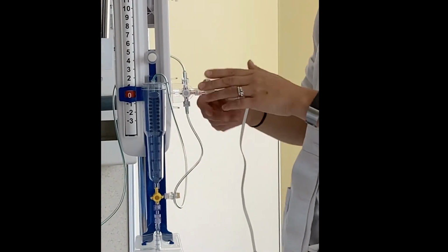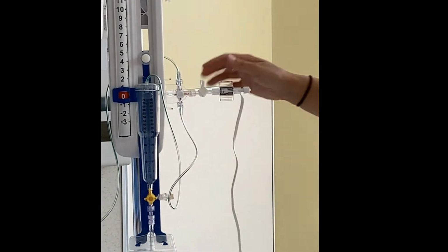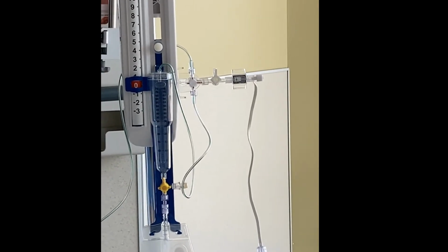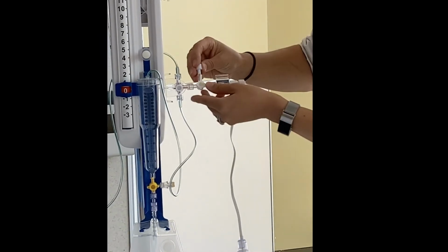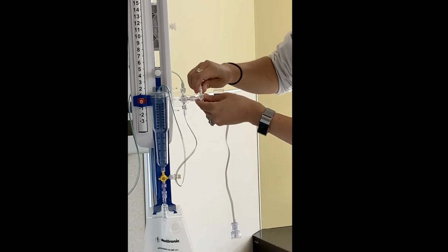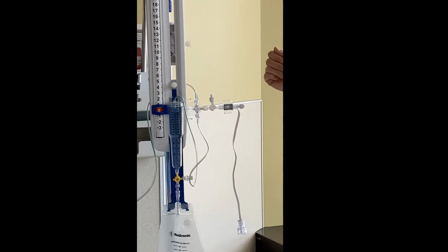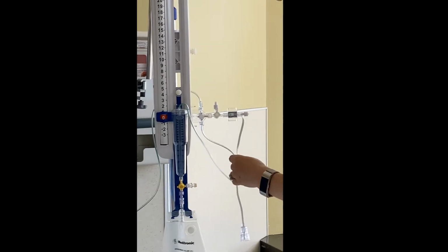This is open, which should never happen. So when I am putting this on with my sterile aseptic technique, I would always put a non-vented cap on it, like so. Okay, because again, we are trying to keep our system sterile inside.